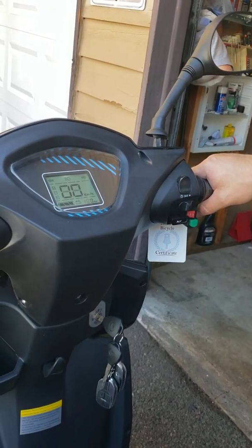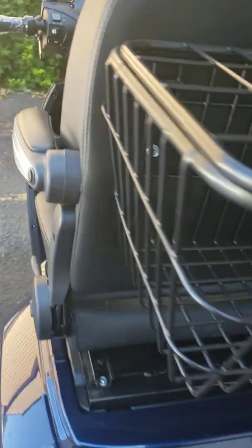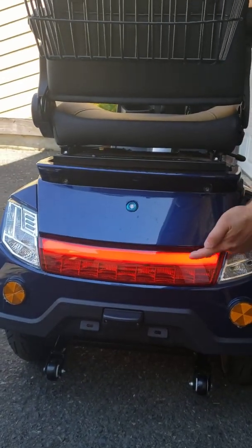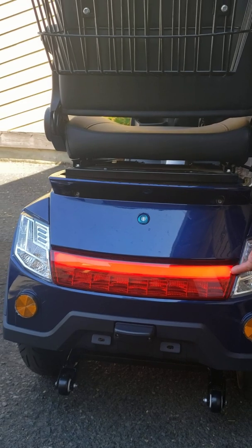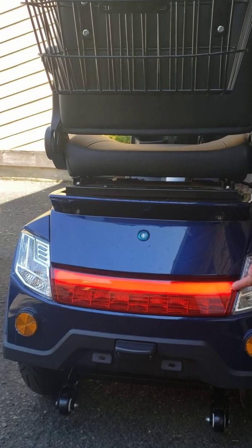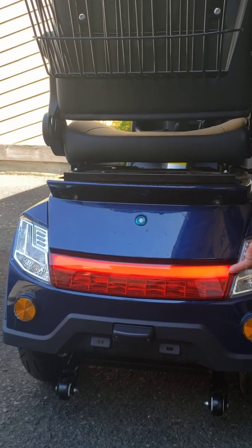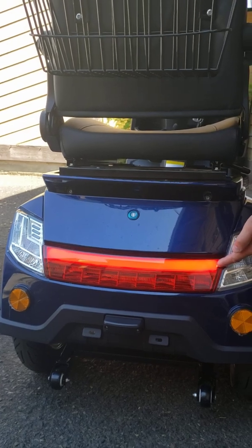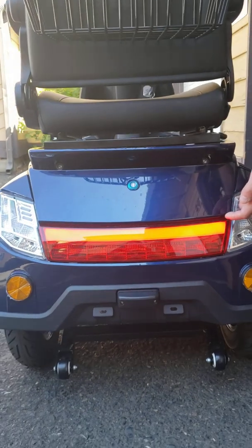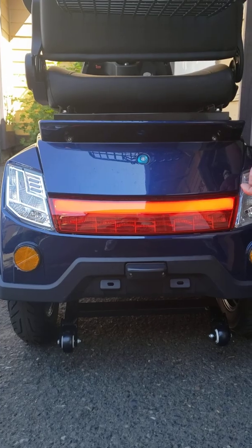First of all, you have to go to the back of the machine and look if your stop light is on. If you see the stop light is on, that means your brake handle switch is in the open position, which cuts off power to the main computer. This means you either have the parking brake applied or you have a faulty switch inside the brake handles.